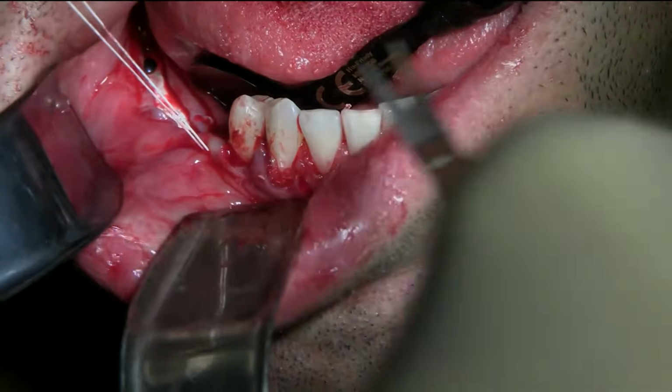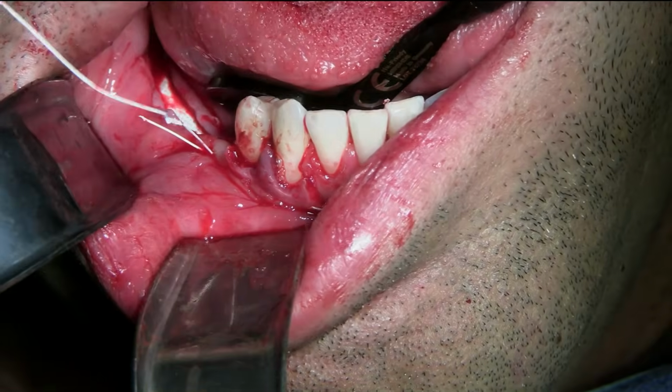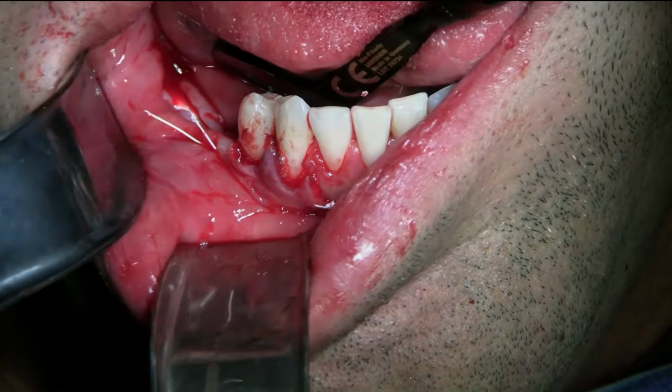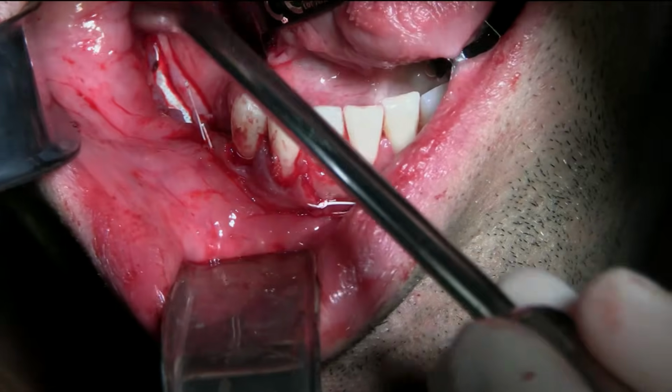Can make it long. This suture will be embedded in the tissue, so good. You're left-handed, so. Okay, so we're good with that one. So the first one is sitting pretty well.